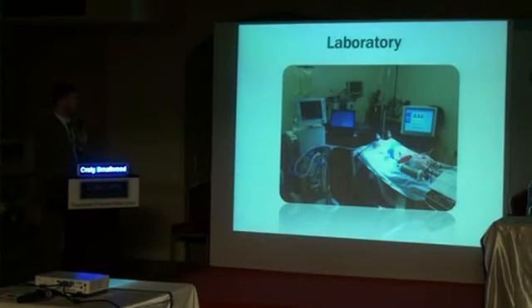All right, so now we're going to take a trip across the street. My office isn't in the same building that the animals are in, thankfully. But we go across the street into our Enders Research Complex, and this is our animal laboratory. So you can see we have a porcine model that I'll talk about in just a second. We have the EIT device over here.